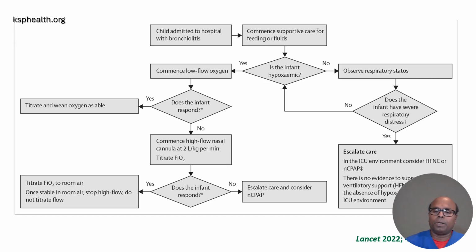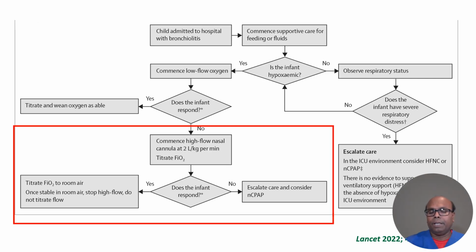If he does not respond, escalate to nasal CPAP. According to this one, practically what we do is we escalate to RAM cannula ventilation. That is our practice.